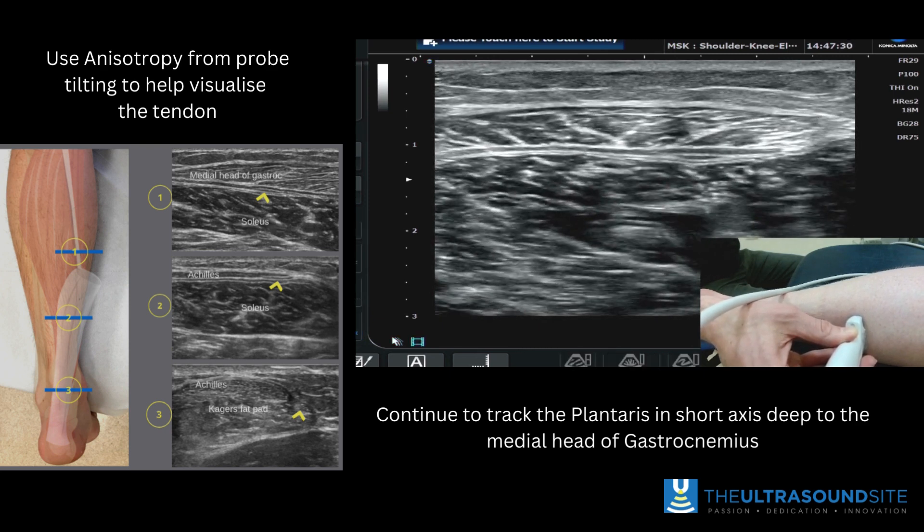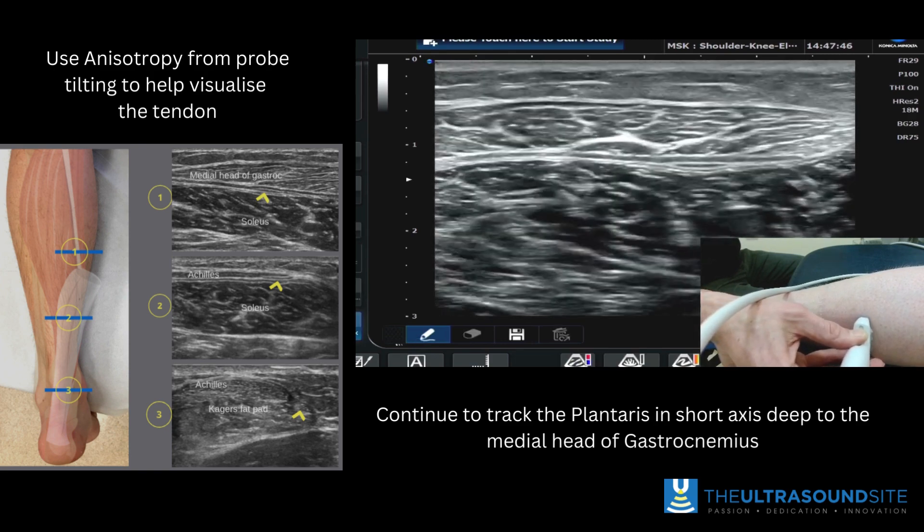You can see here this is the soleus muscle, and then the medial head of gastroc is superficial. In between that you've got the hypoechoic appearance of a small saucer-like structure, which is the plantaris.